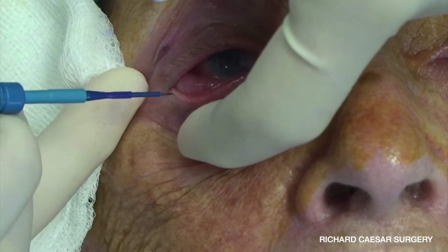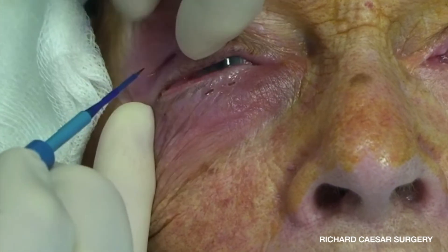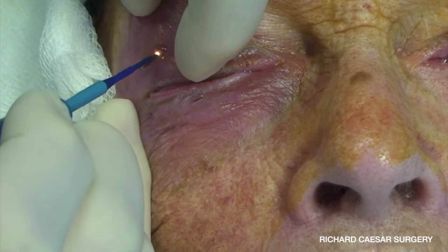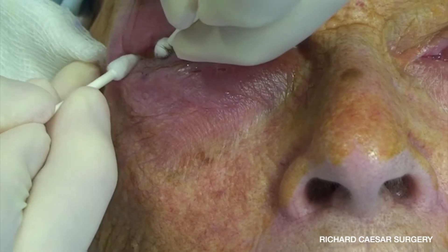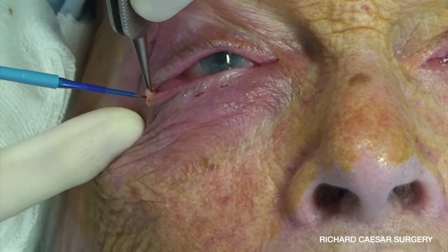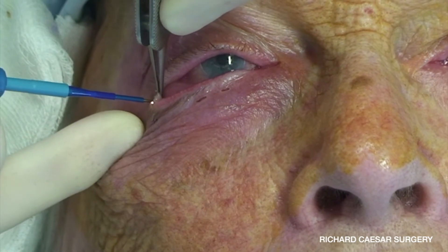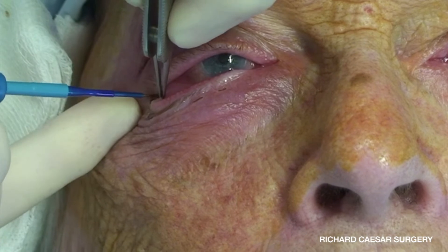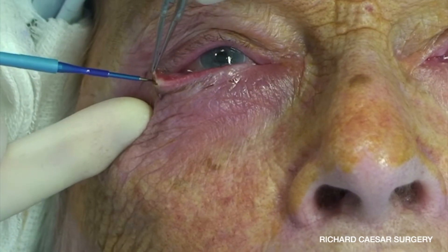My mark has just ebbed slightly, but I'm making the dissection here on the grey line now to split the lid into an anterior and posterior lamella. I'm just deepening the exit point on the lateral incision and then using two cotton buds to push down and fully reveal the orbital rim at that point. To complete the dissection of the strip is just as easy with scissors or a blade, but the monopolar technique means there's absolutely no bleeding, which is very pleasing.